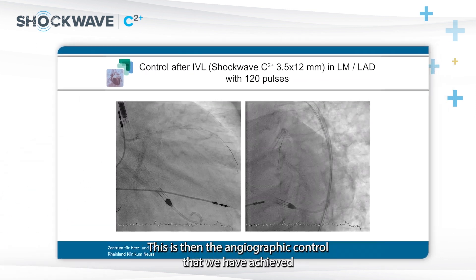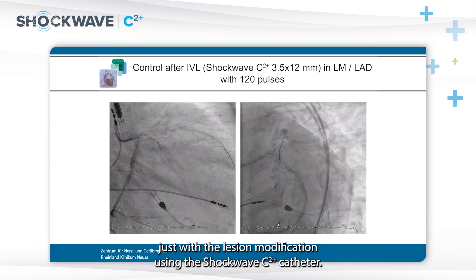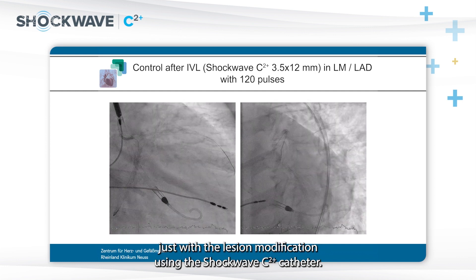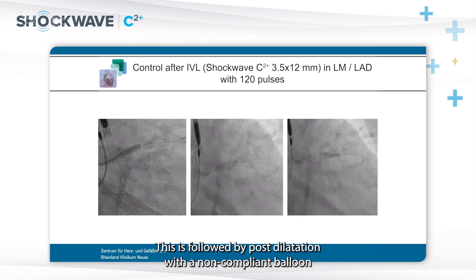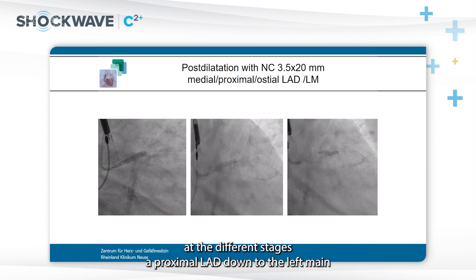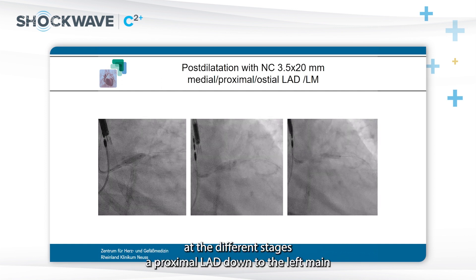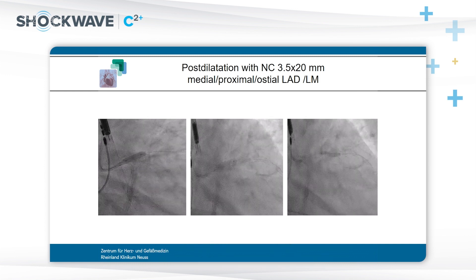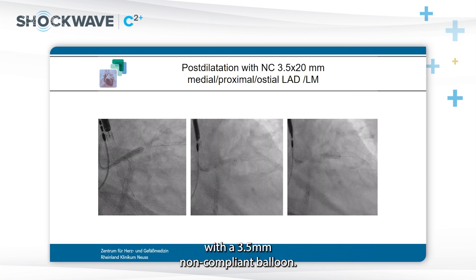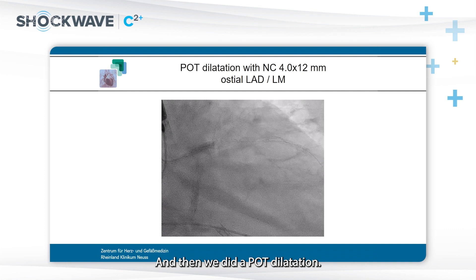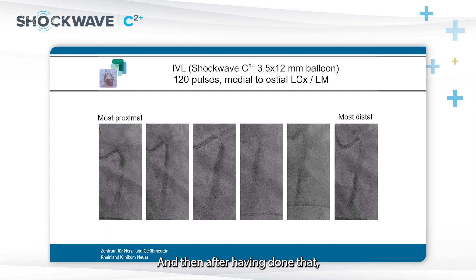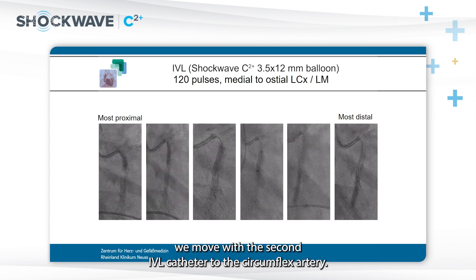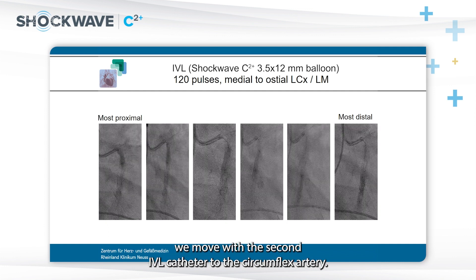This is the angiographic control achieved just with lesion modification using the C2-plus catheter. This is followed by post-dilatation with a non-compliant balloon at different stages — at proximal LAD down to the left main with a 3.5 mm non-compliant balloon — and then a POT dilatation. After that, we move with the second IVL catheter to the circumflex artery.